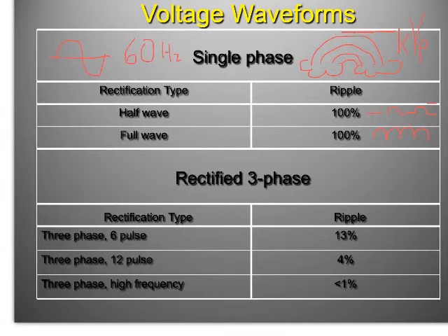But in the past, it was a significant difference. We had to have separate technique charts for our portables and our machines in the department for just that reason. We will come back to this. It's an important thing. It's not going away.